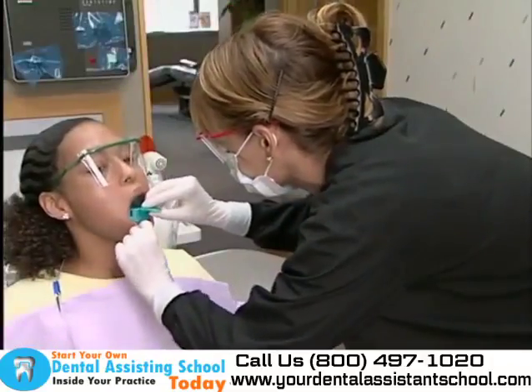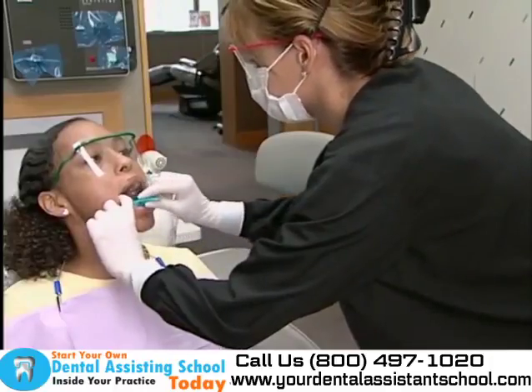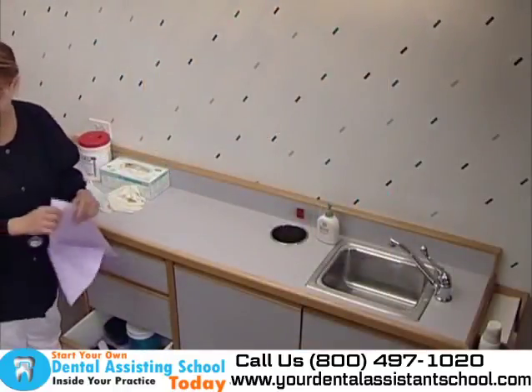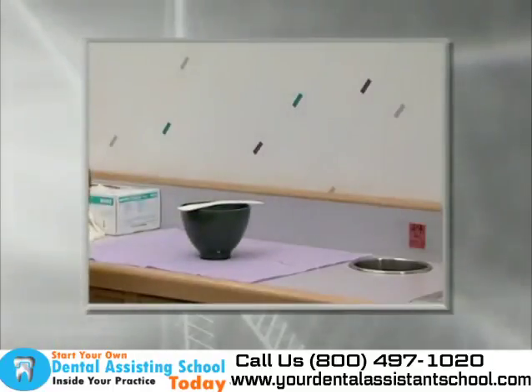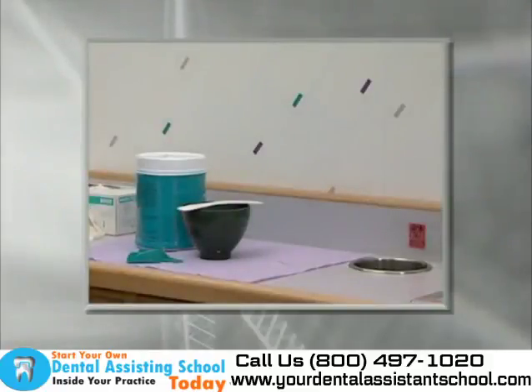Another responsibility of a dental assistant is to take impressions for study models. The dental assistant should first instruct the patient on the procedure and what to expect. To begin, the dental assistant confirms that the materials necessary to make the impression are present. The materials needed include a mixing bowl for combining the water and alginate, a spatula used to mix, alginate impression material, water to mix with the alginate, and metal or plastic impression trays used to hold the impression material.